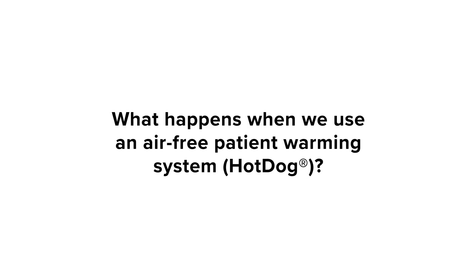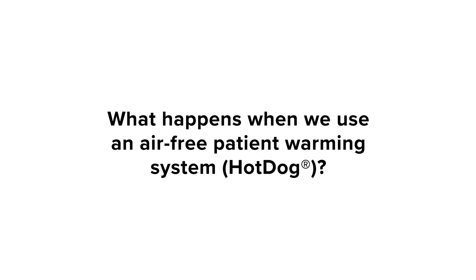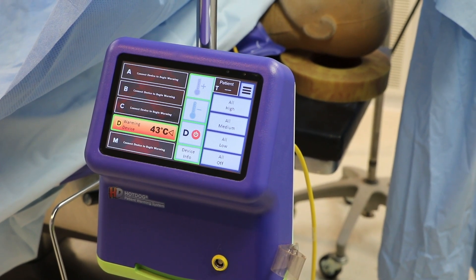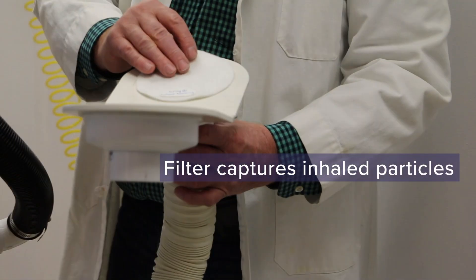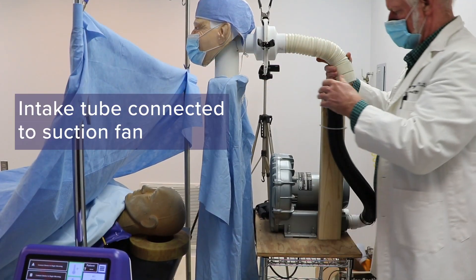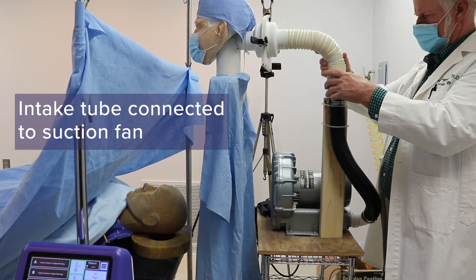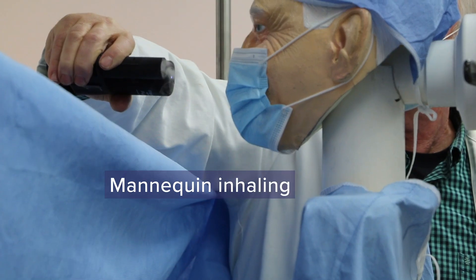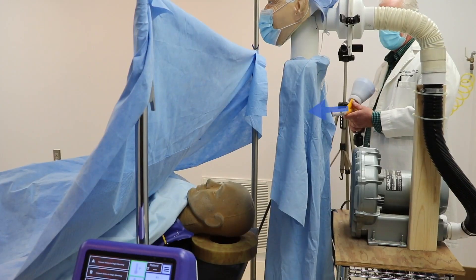What happens when we use an air-free patient warming system? The hot dog conductive fabric blanket is warming the upper body on high setting. A new filter is placed over the airflow path to capture inhaled particles. The intake tube connects the anesthesia provider to the suction fan. Again, the laminar flow system is effective and the inhalation simulator is operating.